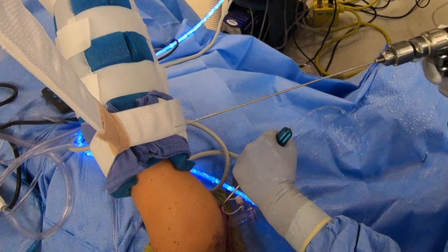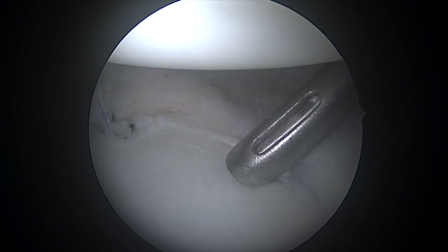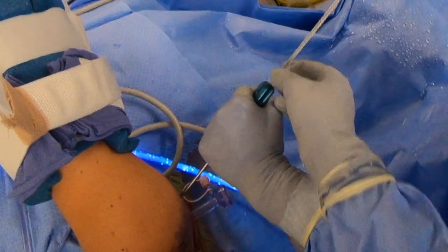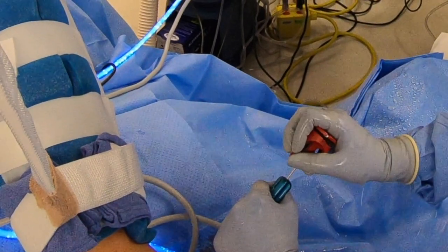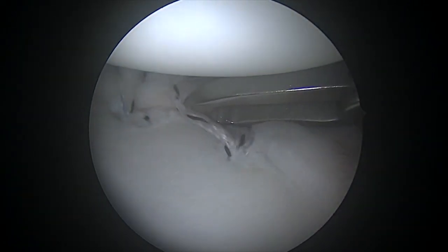We're ready to drill our next anchor, and I try to place these at a minimum of three to four on the front face at or below the level of the bare spot. I use all suture anchors, but you could certainly use PEEK anchors or metal anchors — any of those would be acceptable. The benefit of all-suture anchors is that they're soft, so there's no way they can rub or abrade the chondral surfaces.